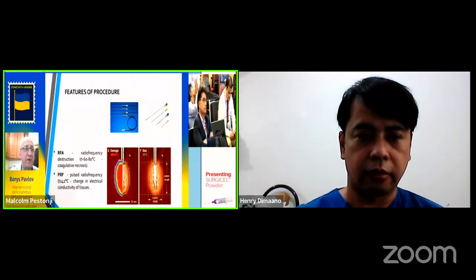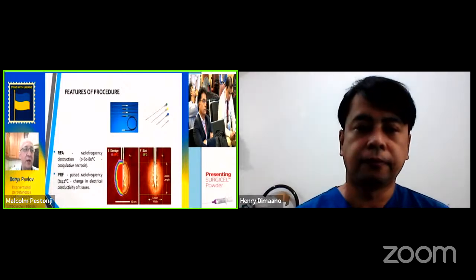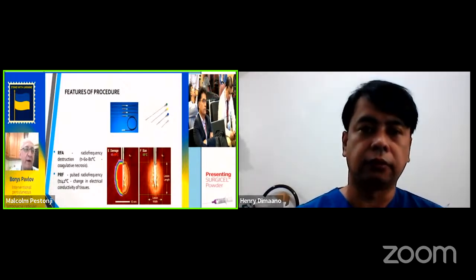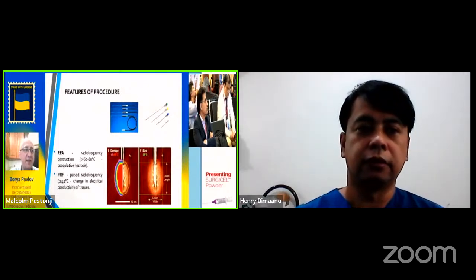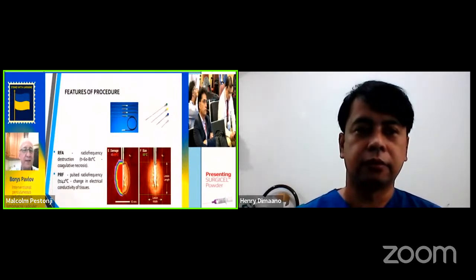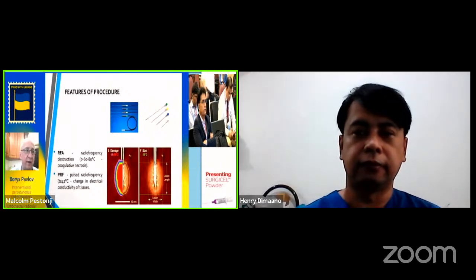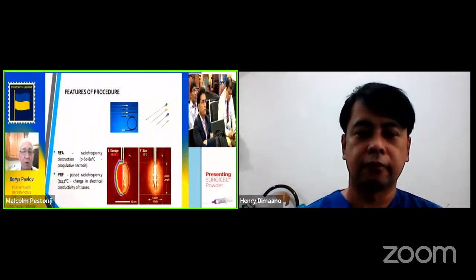The therapeutic field around the tip of the active electrode is approximately 11 millimeters in diameter. It's necessary to distinguish between two fundamental types of radio frequency exposure, which can be set by the generator. This is the constant type of impact and the pulse type of impact. The result of the first is coagulating necrosis. The result of the second is a change in electrical conductivity properties of tissue.